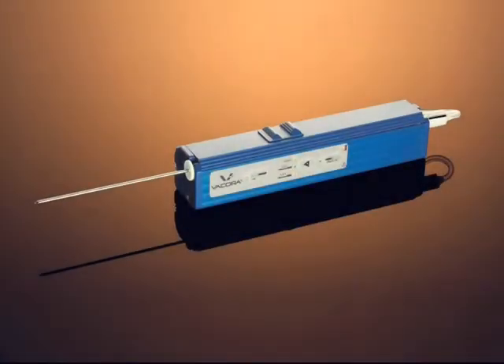The Vacora Vacuum Assisted Breast Biopsy System is indicated to provide breast tissue for histological examination with partial or complete removal of the imaged abnormality. The system is completely self-contained to include the vacuum source and all tubing.